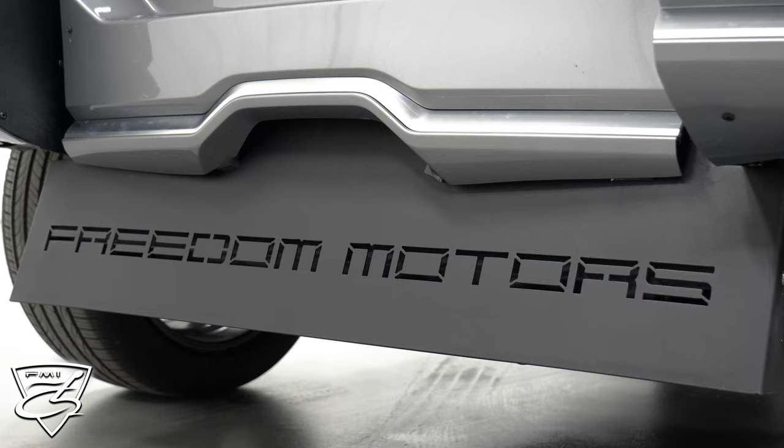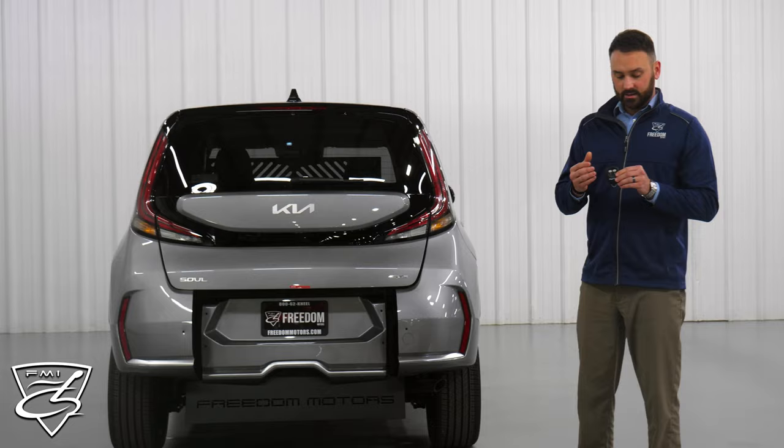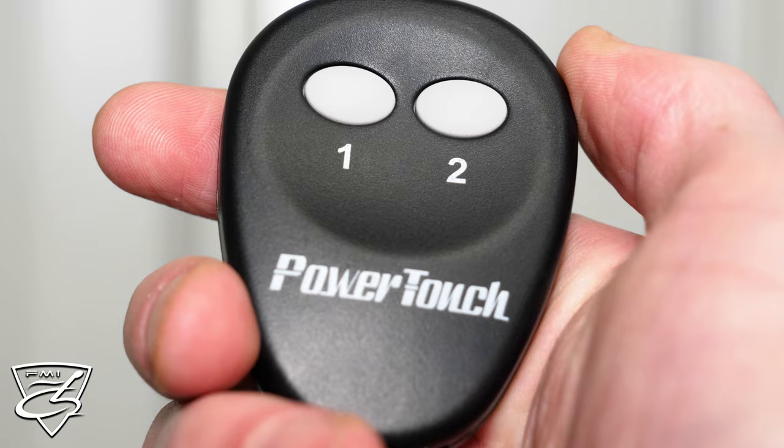One of the great things about our conversions, they come with a key fob with two buttons. Button one, you'll push and hold — that'll open up the conversion for you. Button two closes up everything nice and easy.